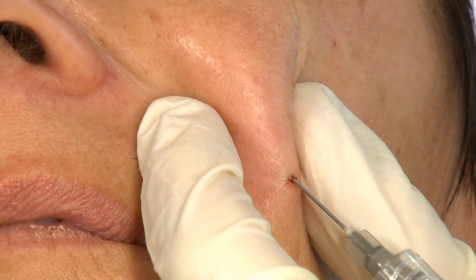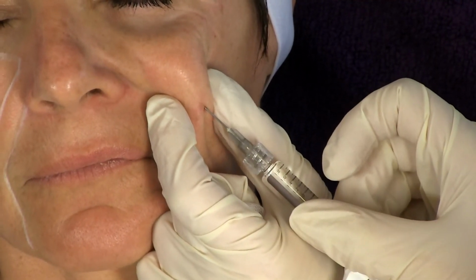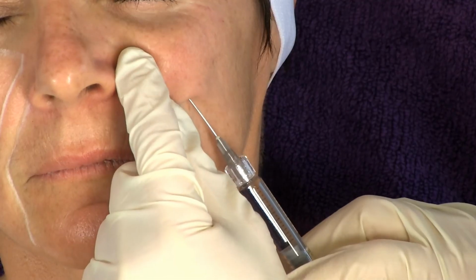Lift the skin with the needle, bevel up, and retract it from the skin. Insert the cannula. Pulling the skin away with the non-dominant index finger and thumb makes it easier to advance the cannula through the insertion point and skin.